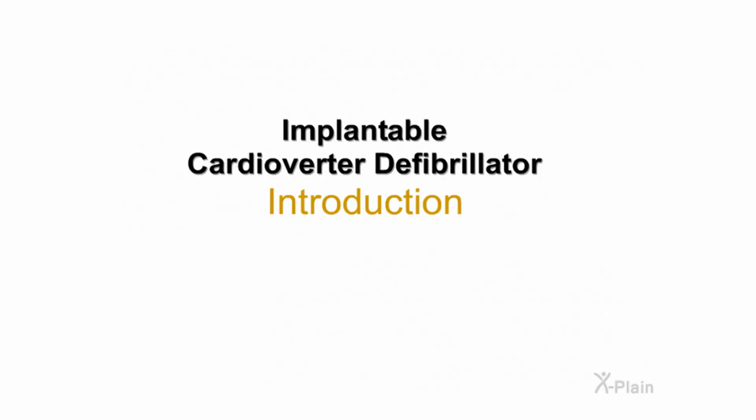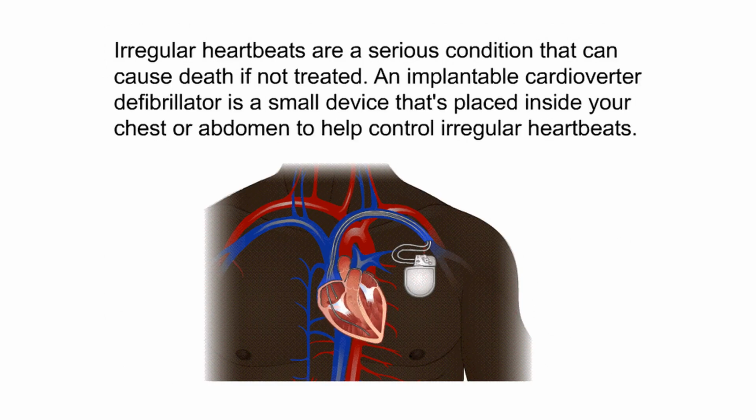Implantable Cardioverter Defibrillator. Introduction. Irregular heartbeats are a serious condition that can cause death if not treated. An implantable cardioverter defibrillator is a small device that's placed inside your chest or abdomen to help control irregular heartbeats.